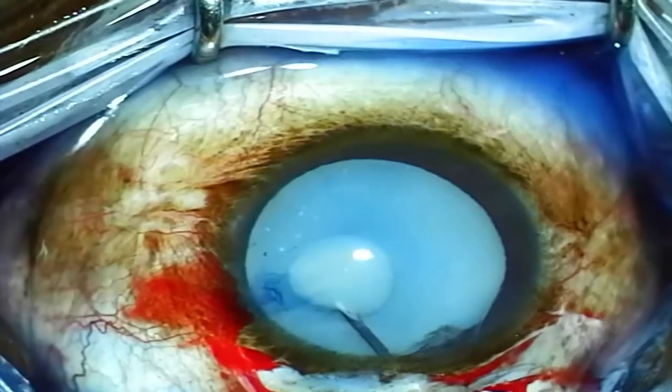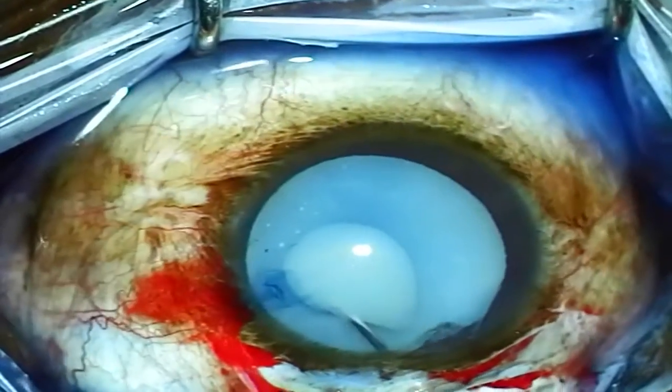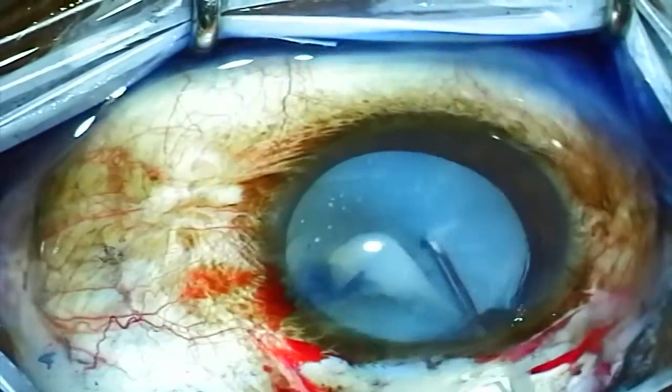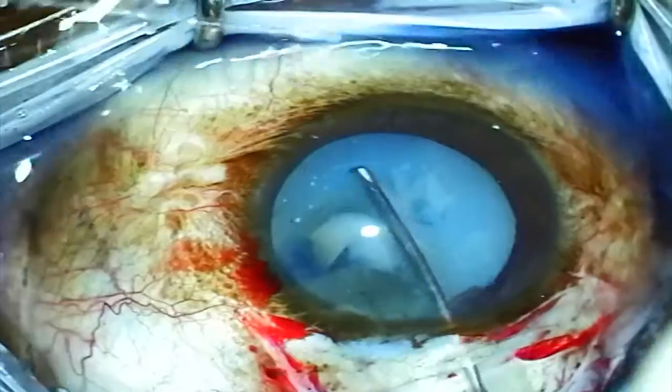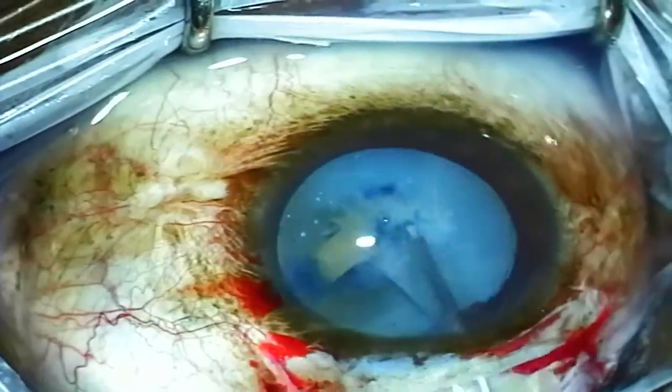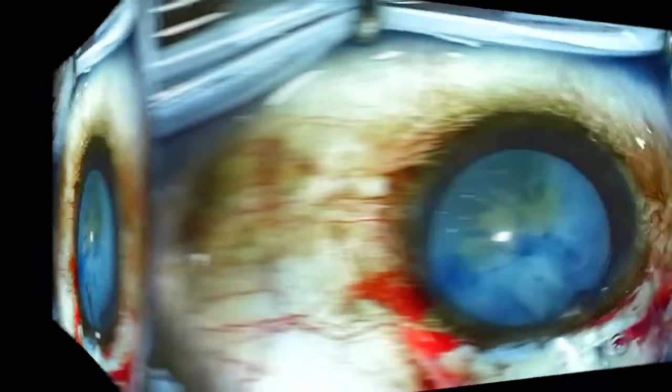I'm using a cystotome to try to create a continuous curvilinear capsulorrhexis, but as soon as I enter the capsule, a lot of lens milk obscures my view. So I quickly give up on that and just go ahead and use a can opener technique to open the lens capsule. As you can see, there's really no counter pressure.